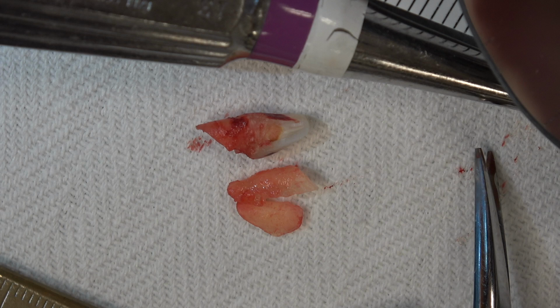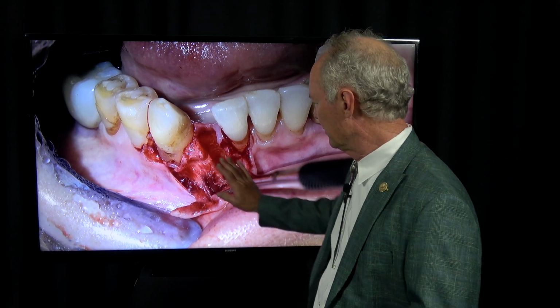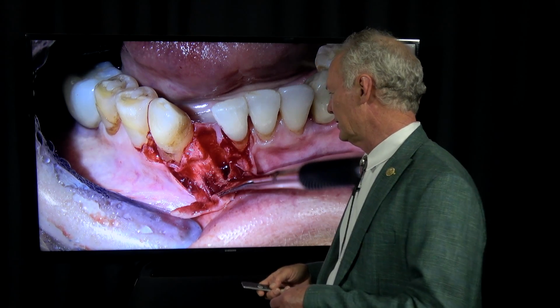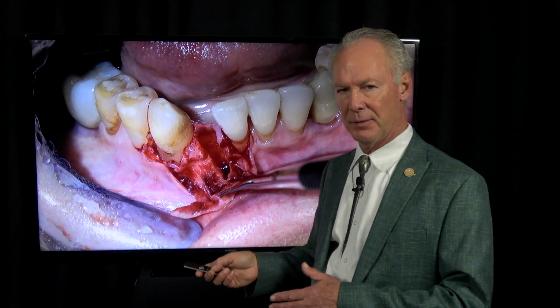Now we've extracted it, so what have we got? Well, I'm not going to place an implant at the time of extraction because most of the facial bone is gone. So I'm going to graft it, and when I graft a socket, I always do this with a multi-rooted tooth. But in a case like this, I'm going to do it with a single rooted tooth. I graft the socket and let the socket heal for 3 months at least before I place the implant.